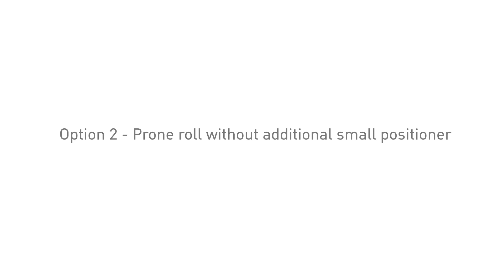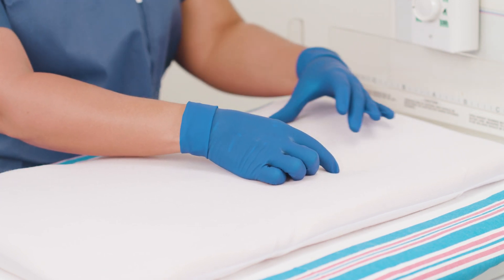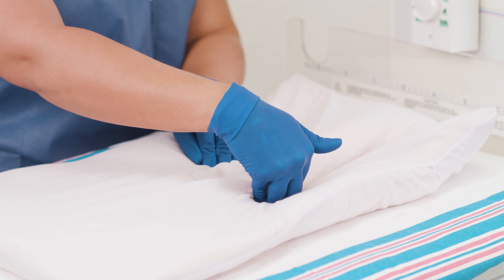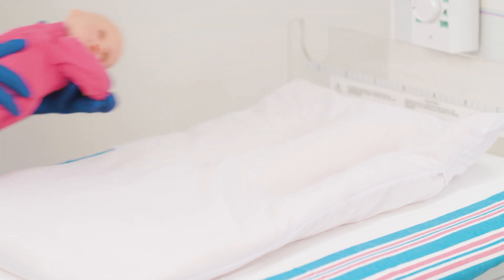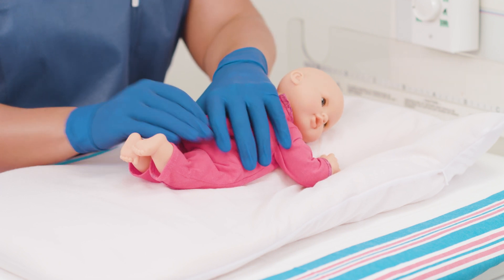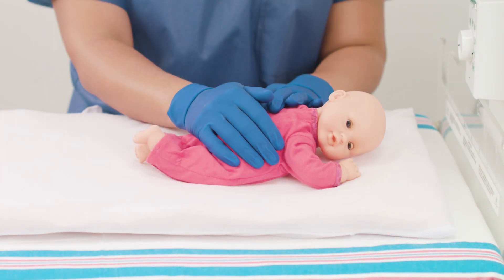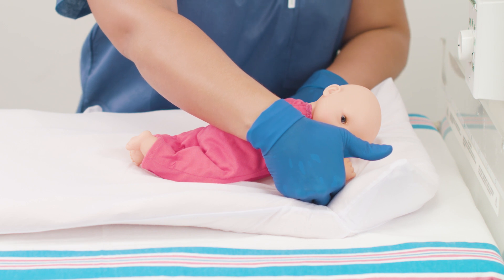Option 2: prone positioning without the additional small positioner. To build a prone roll in the center of the positioner, place a hand on the positioner spaced slightly larger than the desired prone roll. Gently push down and in to create the desired width and length of the prone roll. Place the baby on the prone roll, aligning the shoulders and hips. Make an indentation for the baby's knees. For prone positioning after the baby is already on the positioner, place hands on both sides of the baby approximately one inch away. Gently push down and in to the positioner with hands to create the prone roll.